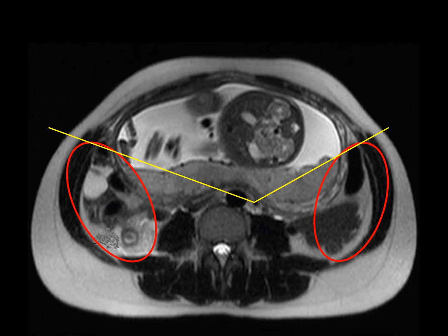And so for a singleton, we have this large sort of sector that we can scan from, and so as we scan across the maternal abdomen, we have really more than 90 degrees to work with.